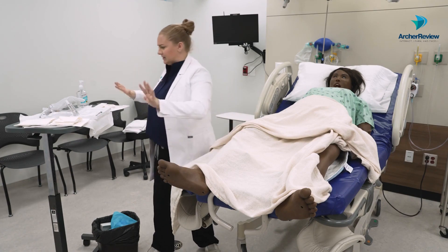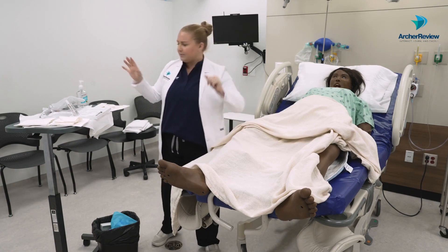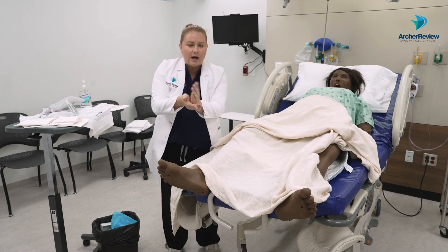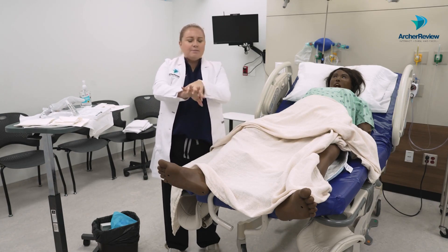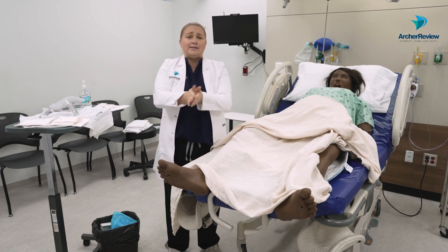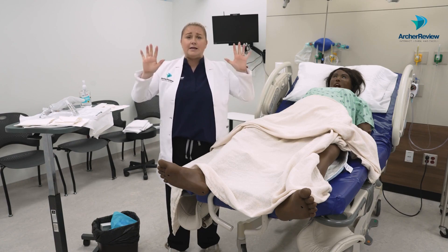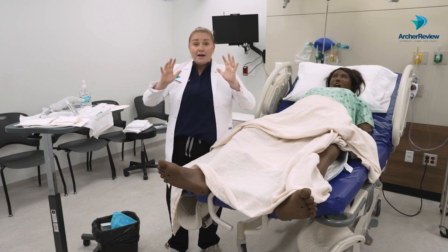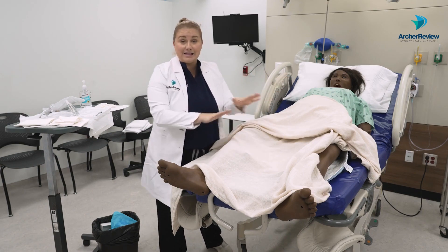Once I've confirmed my supplies and set up my sterile field, I'm going to go ahead and get my hand hygiene going. This is another one where you need a big glob — rub those hands together, get the palms, get the backs, between the fingers, thumbs, rub until there's no more hand sanitizer you can feel. We want this to be really clean so we don't cause that UTI. Then I'll introduce myself, talk to the client, and get this area ready.